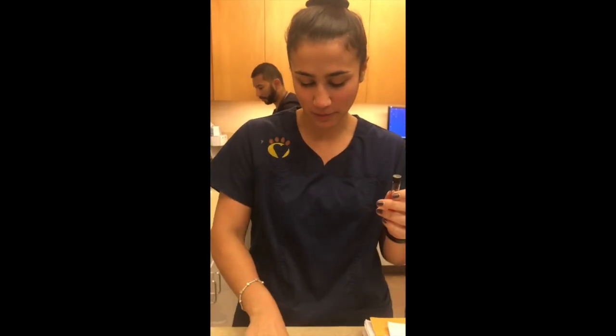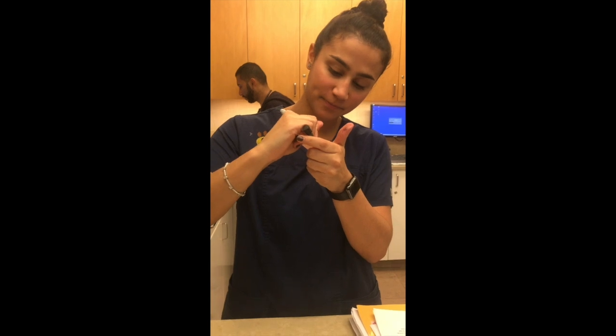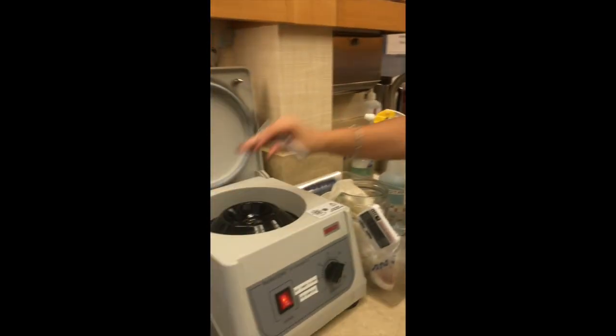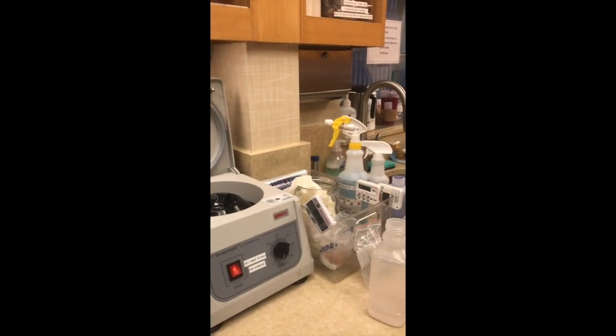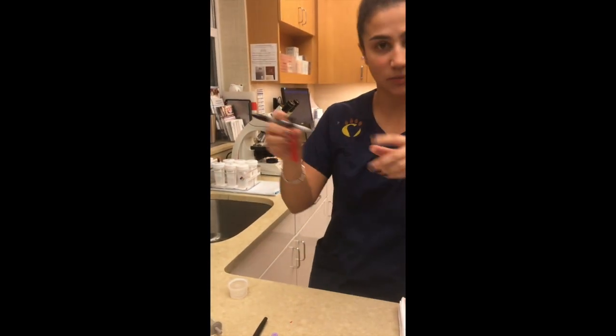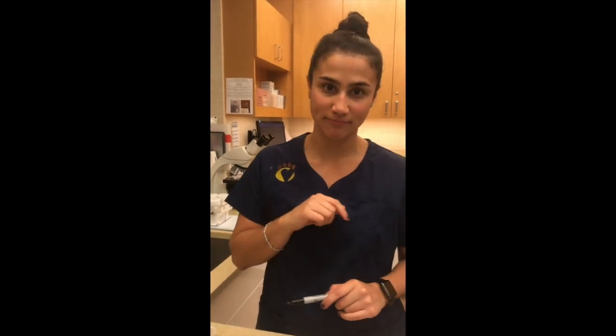Just gonna make sure I label both of them. So first I'm gonna put our recipient's tube in the centrifuge. And then I'm just gonna label our donor's tube. And then put this one in the centrifuge and we will spin. And now we will spin both of these tubes down for 1 minute.